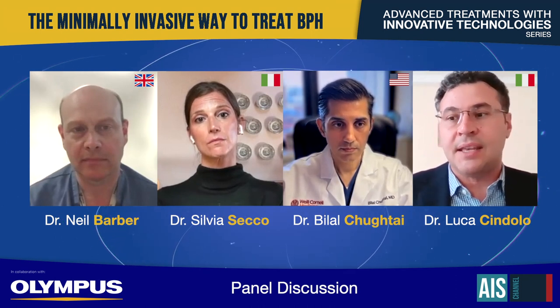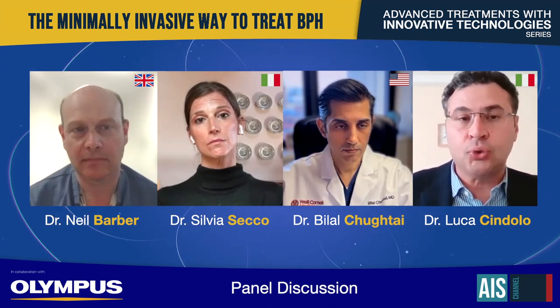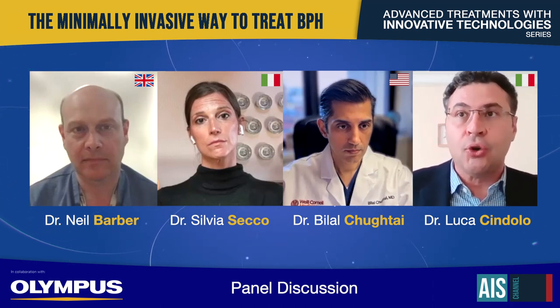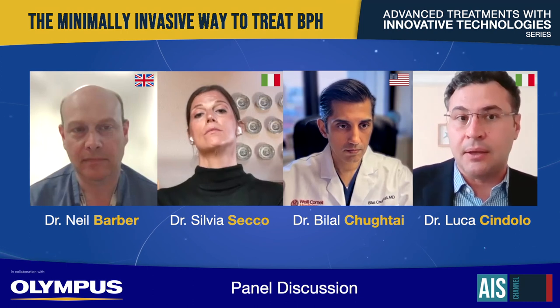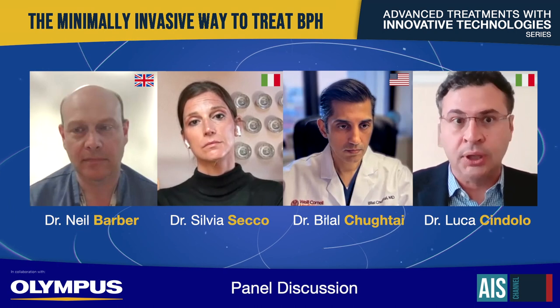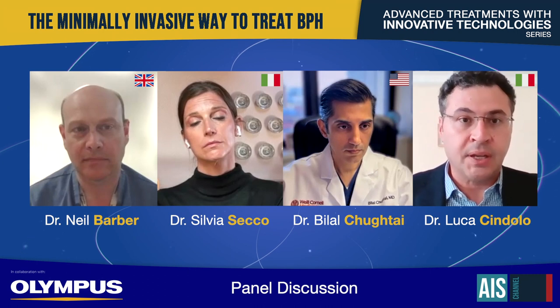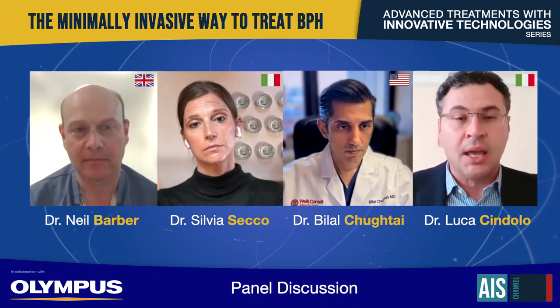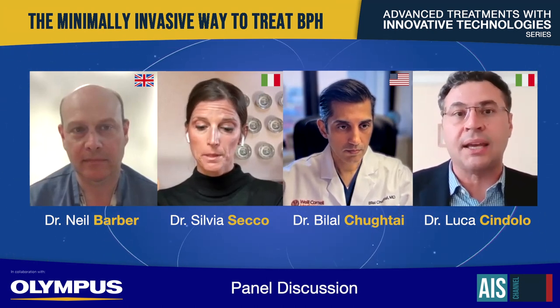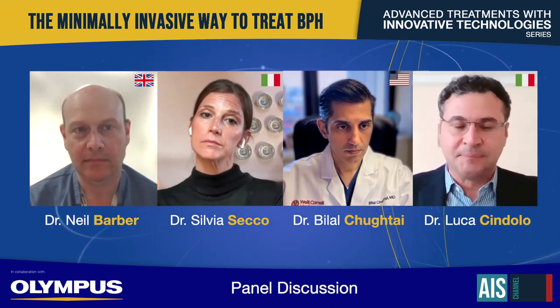The shape of the prostate is another crucial point in the selection of the patient, especially because the iTind is able to incise the bladder neck in three points, and it is better to exclude patients affected with BPH and a third lobe. So my suggestion is to select men who desire to preserve ejaculation and erection at all, with a prostate of median volume without a third lobe. This is the best candidate in my opinion, and in that kind of patient, the success rate is very high and the perception of the patient is highly appreciated.